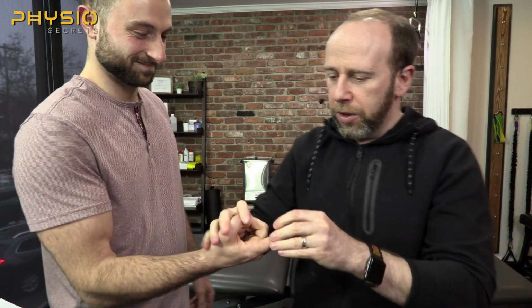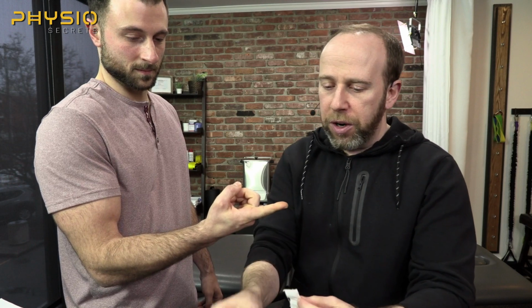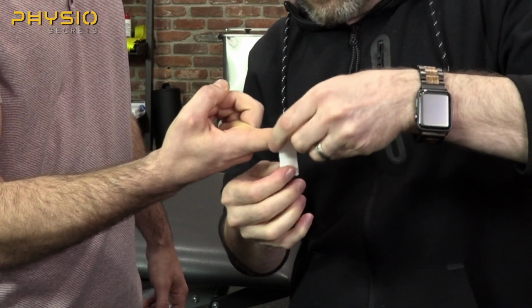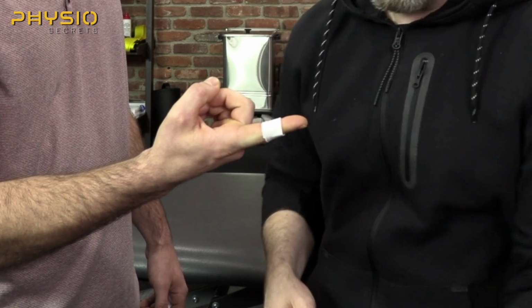Okay, Andrew, let's get that finger over here. All right. So what I want to do is straighten his finger out, and let me squat down here. I want to do it so when I get these anchors on, the finger is relatively straight because I'm not worried about the preposition yet. I'm going to apply anchor number 1. I'm going to try to get that anchor right at that middle phalanx so that I'm not blocking his distal phalange motion. So boom, that's number 1.